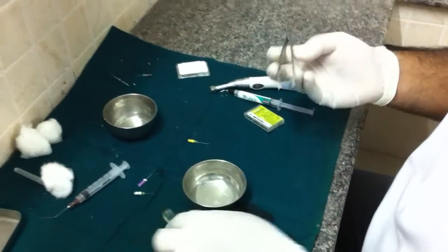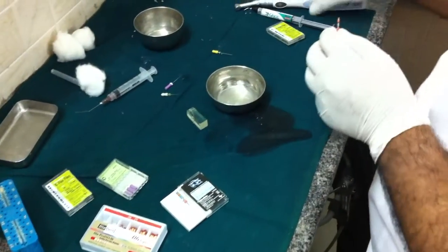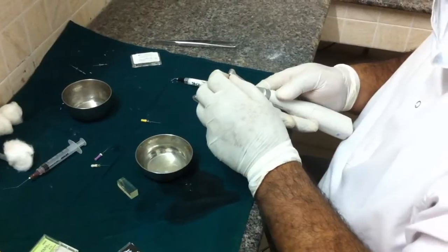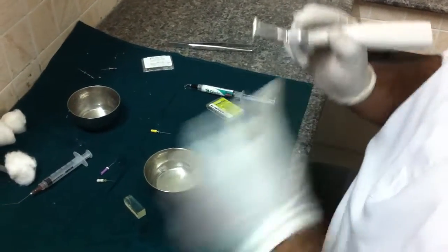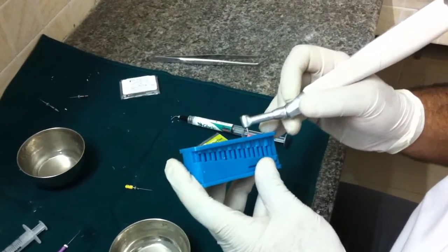Now proceed with the second instrument, the 25 6% taper, to the full working length.